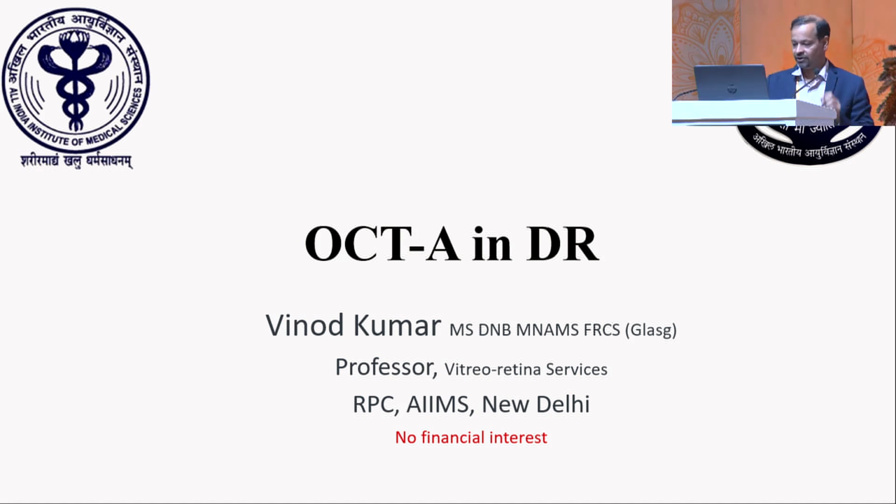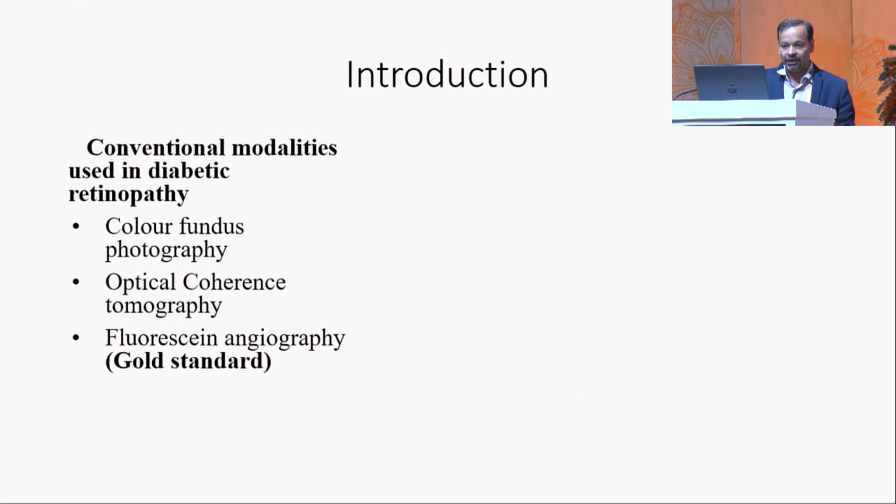So I'll be talking about OCTA in vascular pathologies, and mainly I'll talk about diabetic retinopathy. At the outset, I'd like to thank Ankur for having me in this course. We know that when we assess diabetic retinopathy, we have certain standards of care, and we very commonly use OCT, we commonly use fundus photography, and the gold standard is fluorescein angiography, which has been there for long.